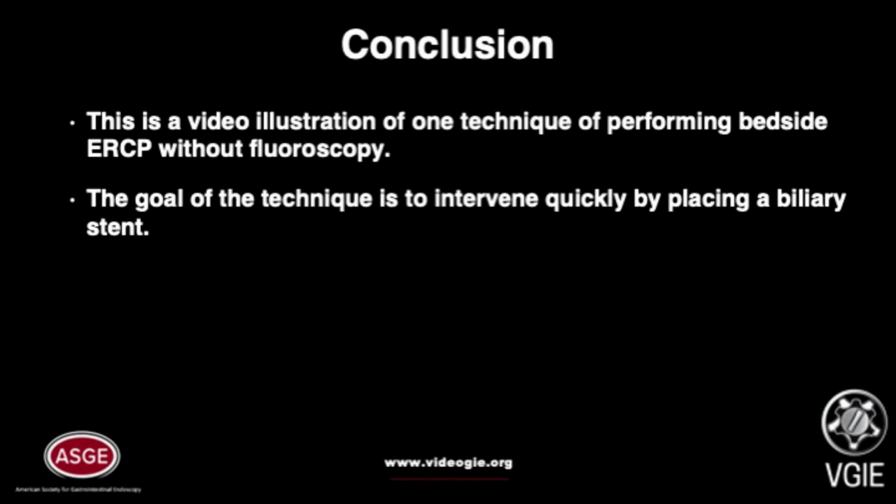This is a video illustration of one technique of performing bedside ERCP without fluoroscopy. The goal of the technique is to intervene quickly by placing a biliary stent. Thank you.